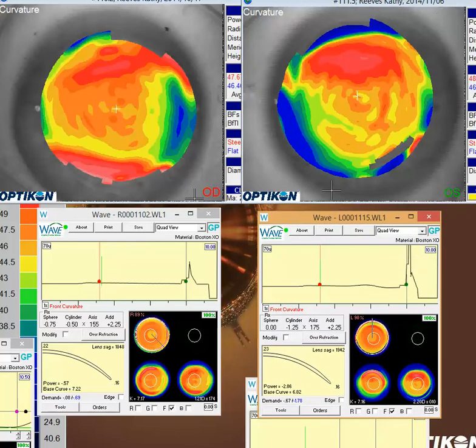So with that said, let's go back and look at the design. Oh, before we talk about that, you mentioned you're getting some filming of the lenses also. A couple thoughts with that. It could just be a poor wettability from surfacing when they made it, so obviously you could try cleaning it well with a Serene cleaner or a Lobob cleaner or even Miraflow if you have any of that laying around.